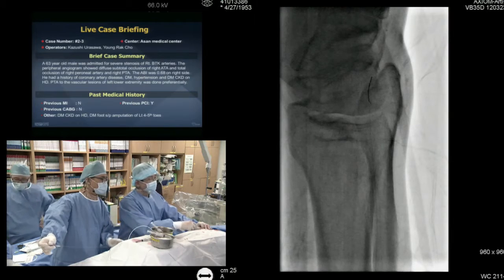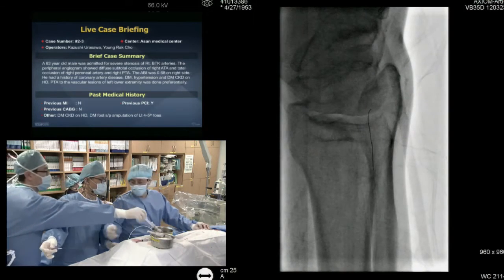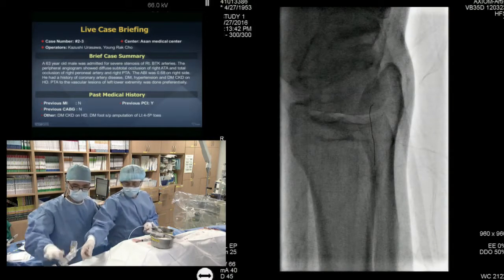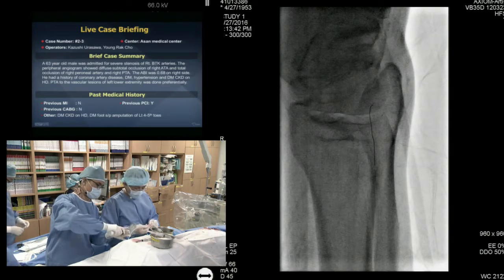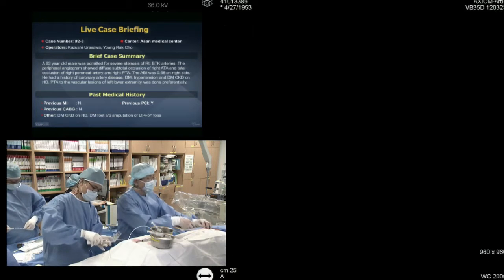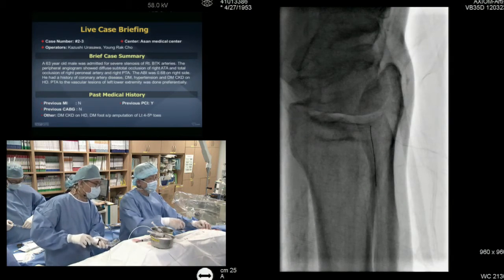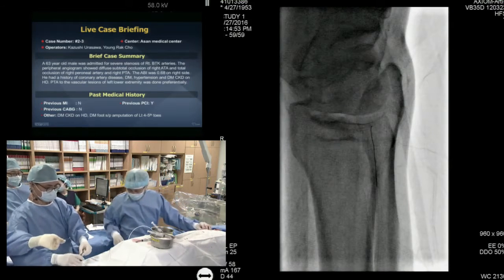No, not good. There you go. You have to, can I have the inflator? Just a little bit. Yep, okay. 20. I'll try 20. There you go. So, can I have a 2.5 millimeter balloon?